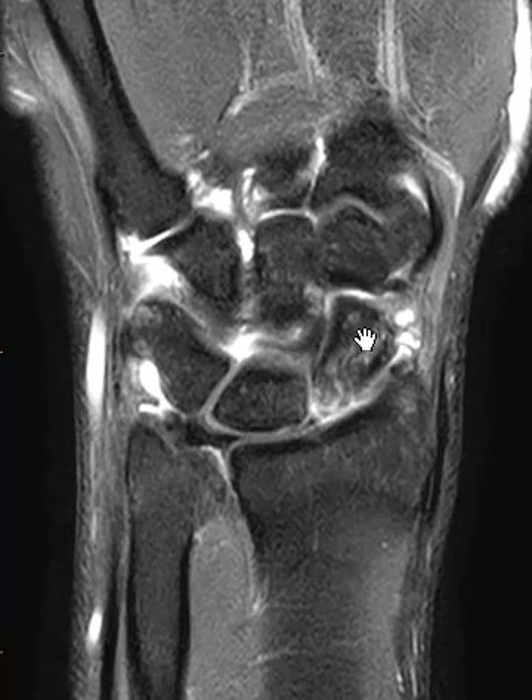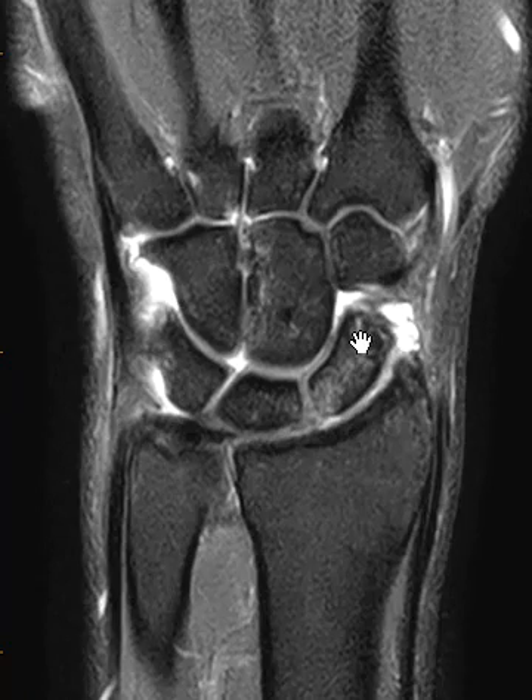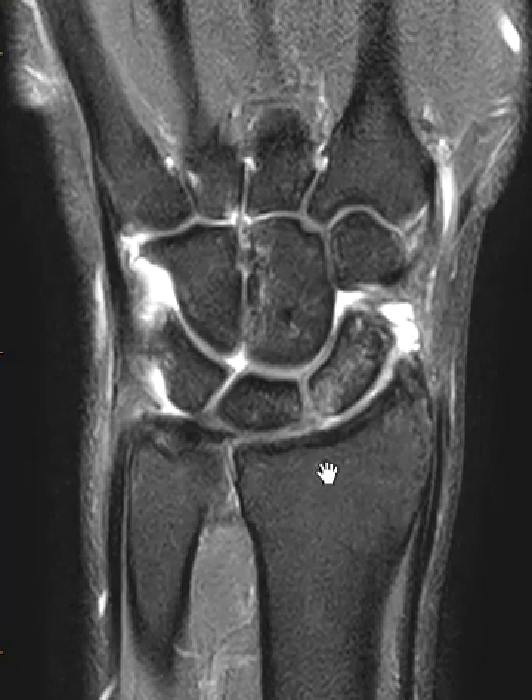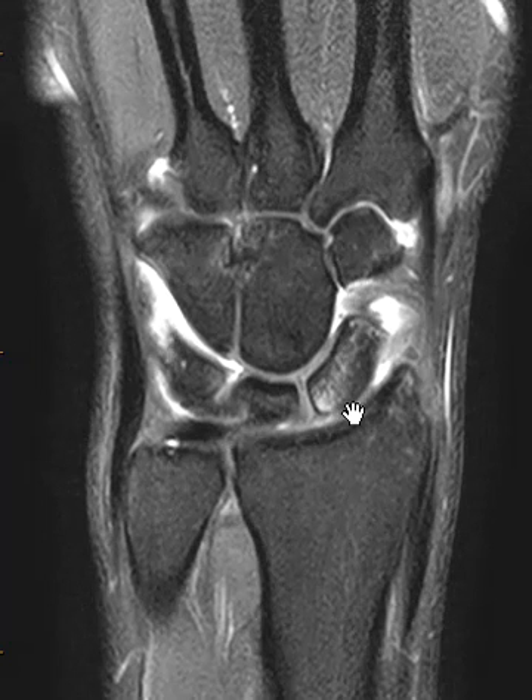The rest of the scaphoid is also a little abnormal — it looks like it has an injury, a bone contusion or stress injury. The scapholunate ligament we can see here is not completely torn and there is no scapholunate widening, but it does look a little bright, so it is probably partially torn, especially with the marrow edema here.